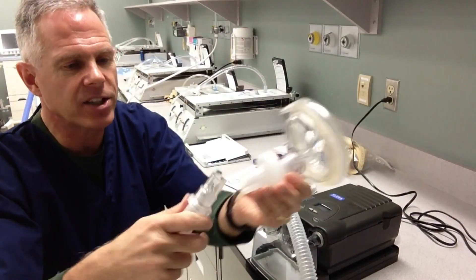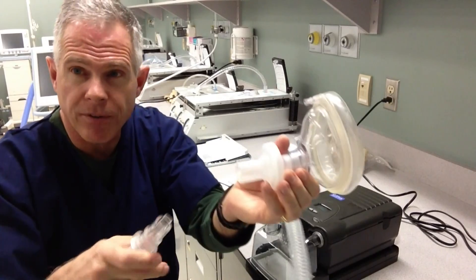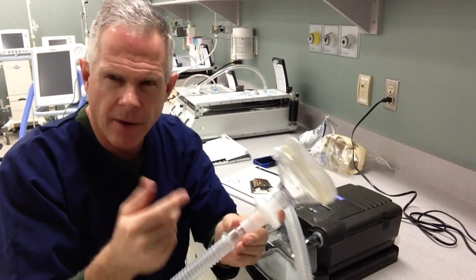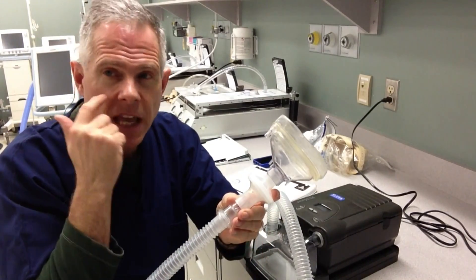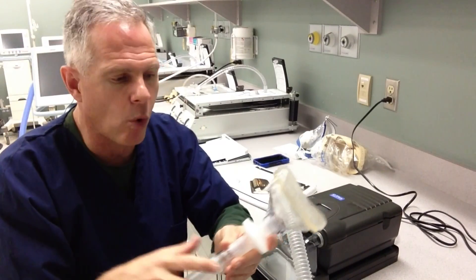Their mask will attach just like this. We may use a specific full face mask like this, or more often with a home unit it might be just a nasal mask for the patient. They'll have a variety of head straps to hold that on.